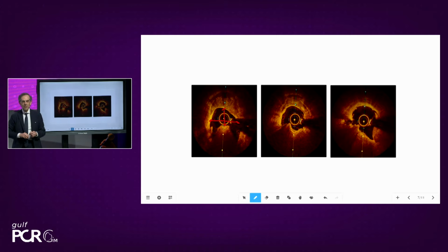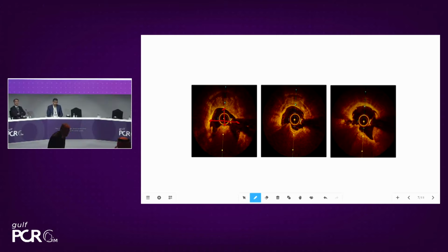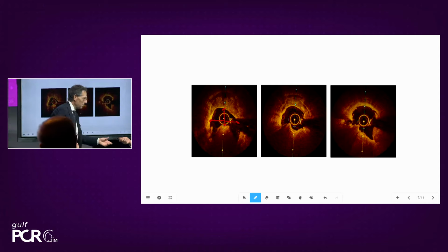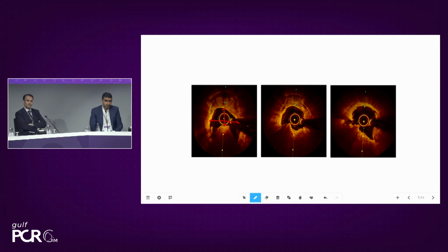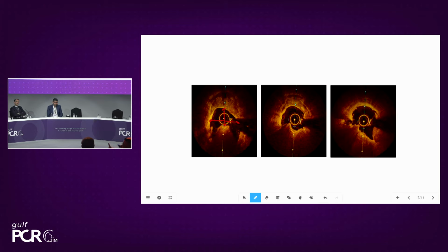Questions? Please, challenge us. Excellent case. Now, the proximal needs to be optimized. It's only 66, I need something like 90 probably, based on the lumen data. The distal one is okay, but while working, you lost the OM. Seeing the OCT with the angio, I would check my ACT. The reason is that, if you show us the last angio, the OM went off. So, I have the answer for this.